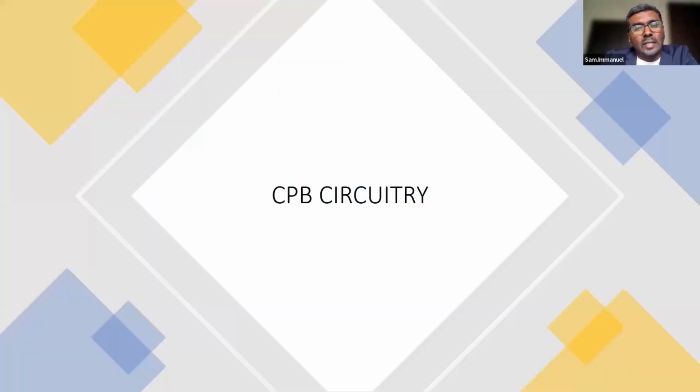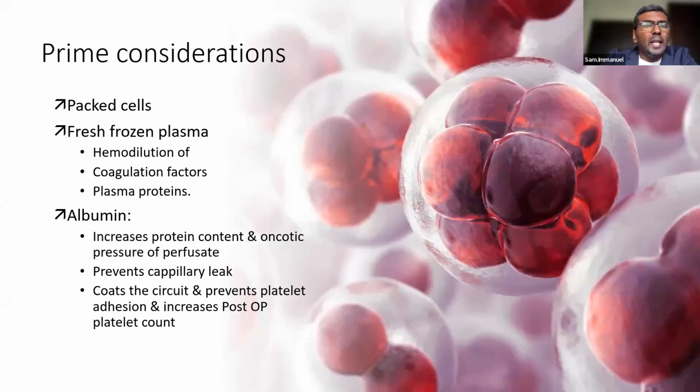Okay, going to the circuit. Why do we need to focus on the priming solution, which was already spoken about before? I just wanted to cut short and make it in a nutshell.